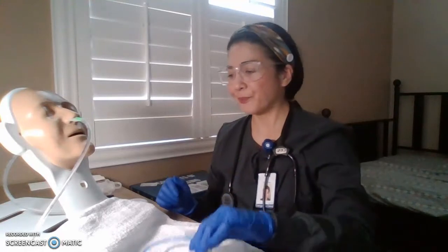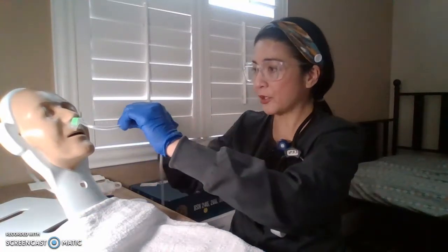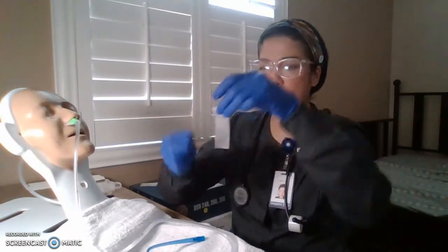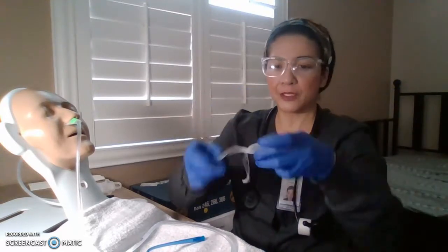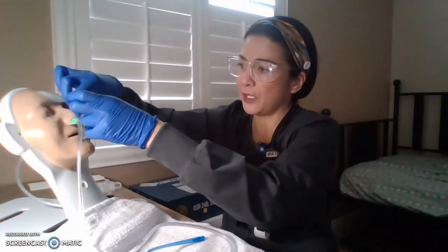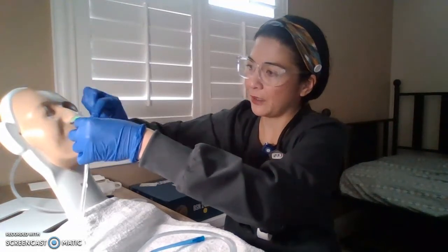All right. So now that we've done the checks, the placement, we're now going to secure our tubing. So usually what some do, you get a piece of tape, you split it in half, you're going to put it on the bridge of the patient's nose, like so, and you're going to wrap the tubing like a candy cane.